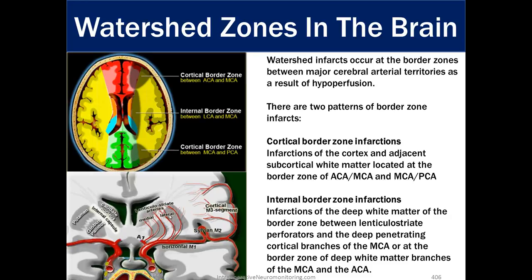But if something happens and we have some ischemic event subcortically, the EEGs aren't going to be able to record that because they only record the most distal brain activity. Our SSEPs have to go through the internal capsule before we get our cortical N20 generator. So if we see a loss of that, we could be picking up a deep ischemic problem as well.